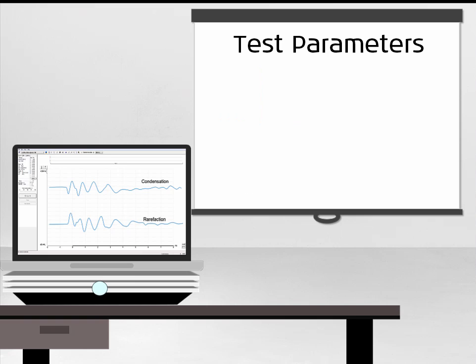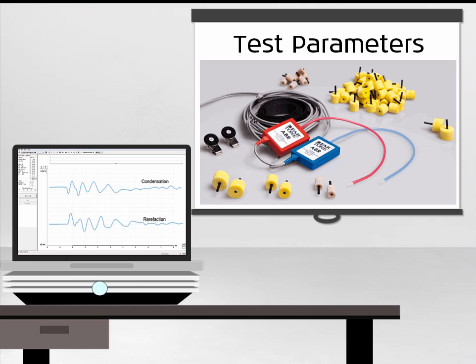When recording using a single polarity stimulus, a stimulus artifact can also be recorded. It is therefore recommended to always use insert earphones when recording the cochlear microphonic, as these create a delay between the stimulus artifact and the cochlear microphonic itself, making it easier to see on the screen.